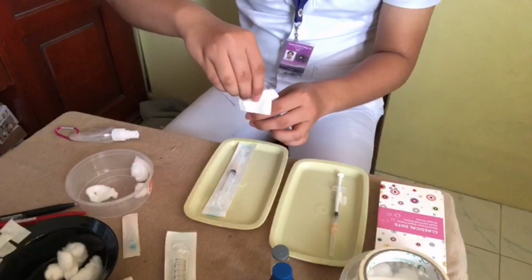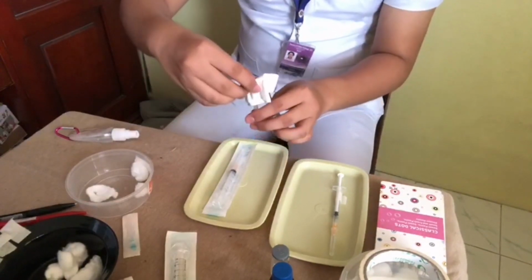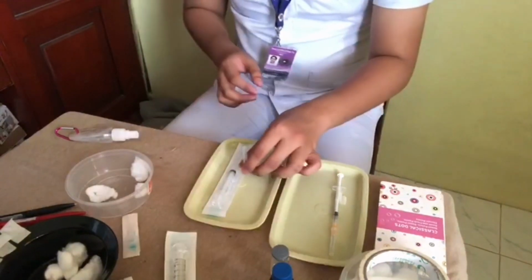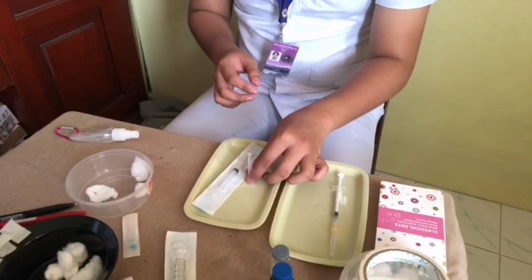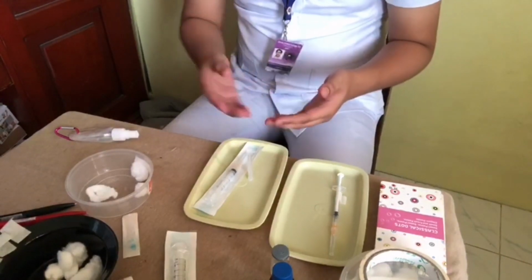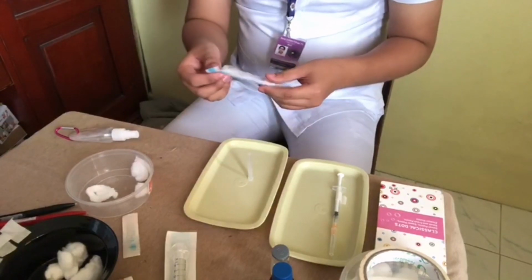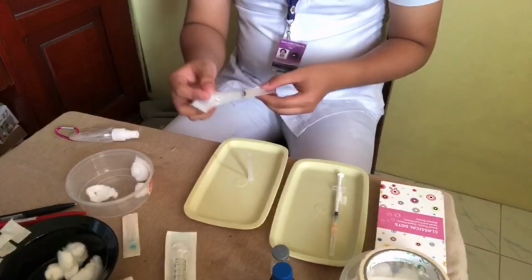After that, discard the broken top piece of the ampule carefully. Then we'll now withdraw the medication from the ampule. So we have our ampule on a flat surface, and we already have here our syringe with a filter needle attached.